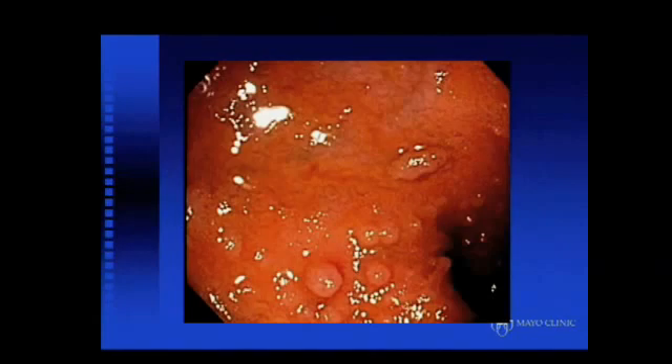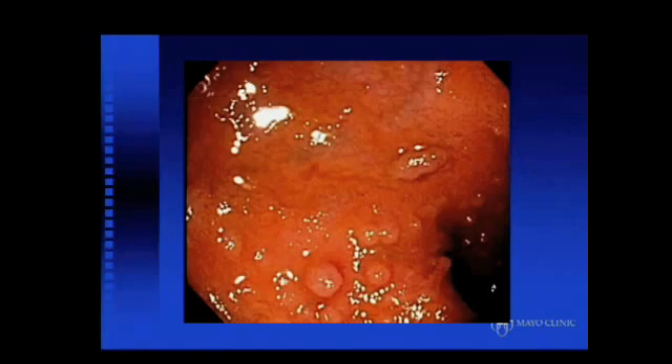If you have an electronic system, I find it important to take a picture of the appendix to confirm cecal intubation, take a picture of the ileocecal valve, pictures of other findings, and on withdrawal, pictures of retroflexion in the rectum. The terminal ileum has a classic lymphoid proliferation and almost a velvety appearance of the mucosa of the small intestine, confirming intubation of the terminal ileum.